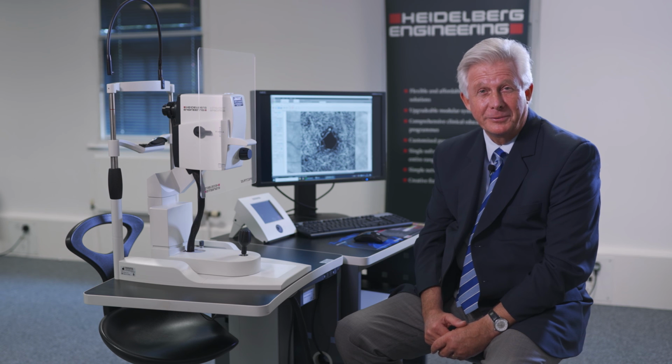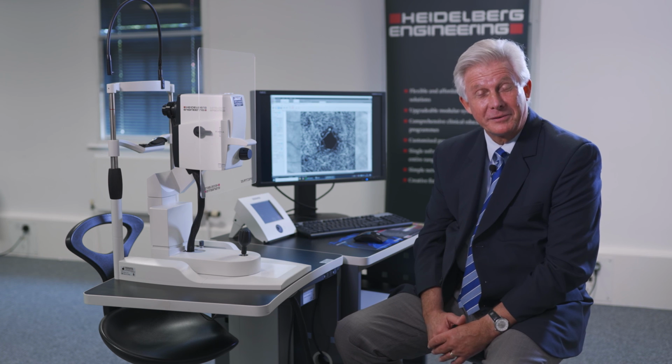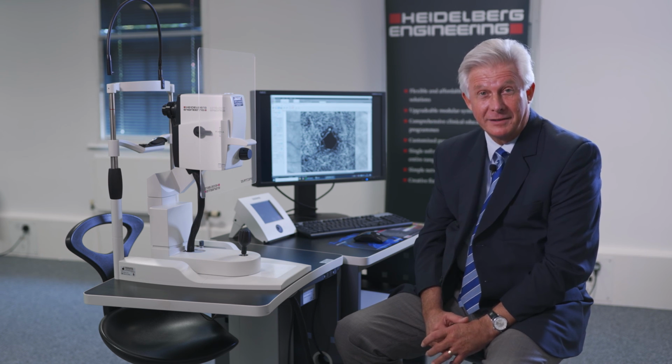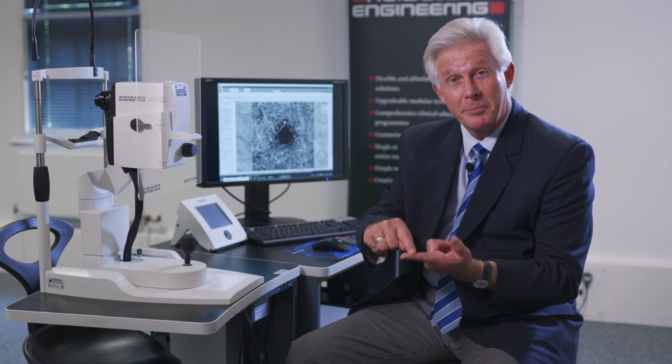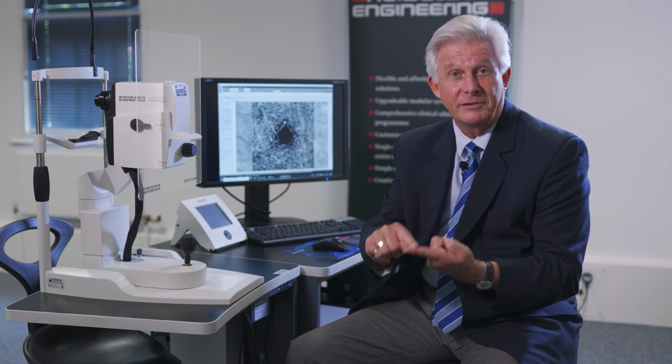We're trying to capture a consistently inconsistent moving entity, these red blood cells going through capillaries. And so this is quite challenging technically. And so we like to think we have Spectralis DNA, and you need these key components to make good OCTA imaging. So first of all, you need the resolution to be able to image those capillaries. Secondly, you need TrueTrack live eye tracking to be able to stay on that capillary. And then you need to be able to do sufficient sampling because of the inconsistent flow.